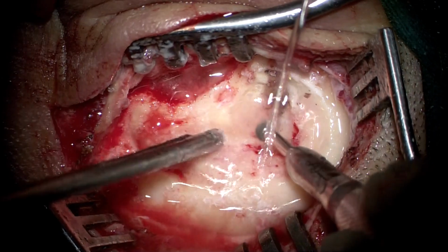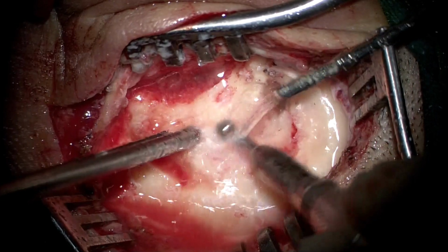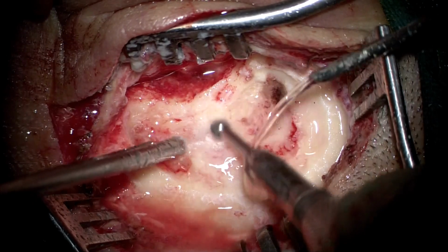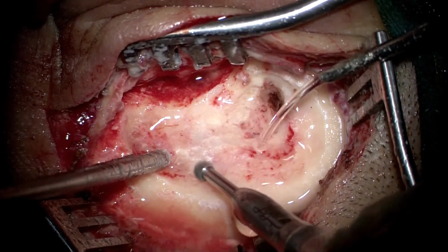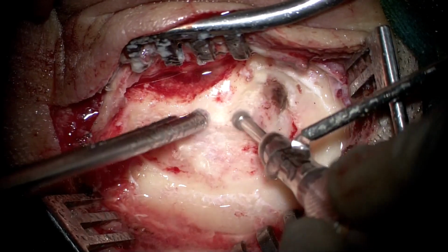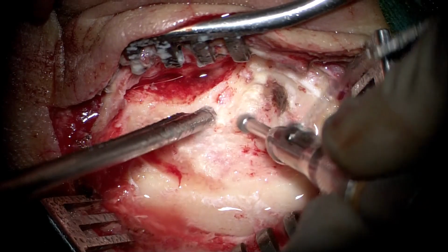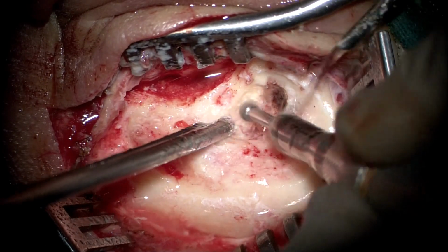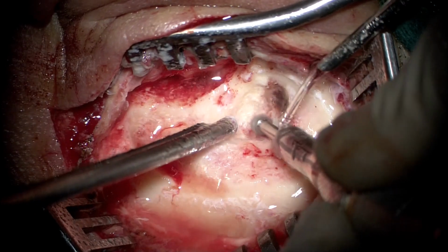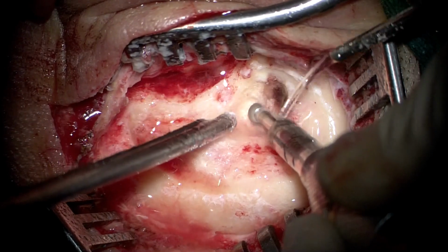This is the demonstration of a left-sided labyrinthectomy, transmastoid labyrinthectomy. Here we can see that we have begun doing a cortical mastoidectomy in this patient, and this patient happens to have a markedly sclerosed mastoid on the side on which labyrinthectomy is to be done. This is a patient of end-stage Meniere's disease with multiple episodes of refractory vertigo post sessions of gentamicin, and this is being done as a final definitive ablative procedure to correct the vertigo.